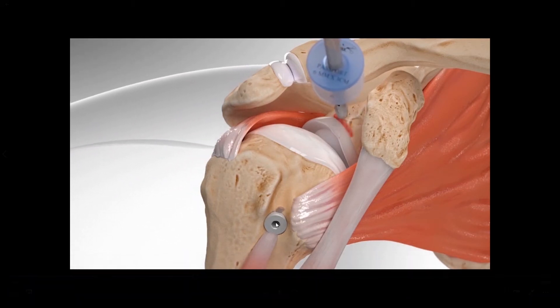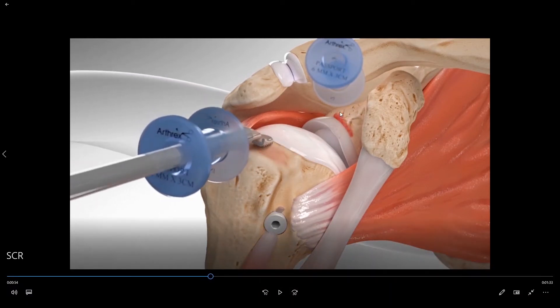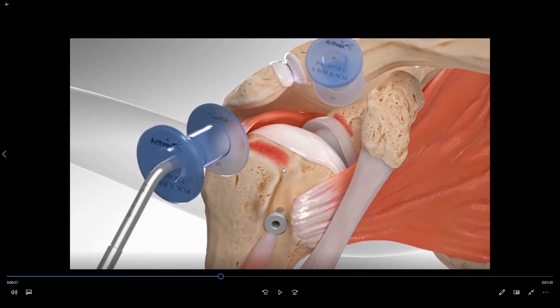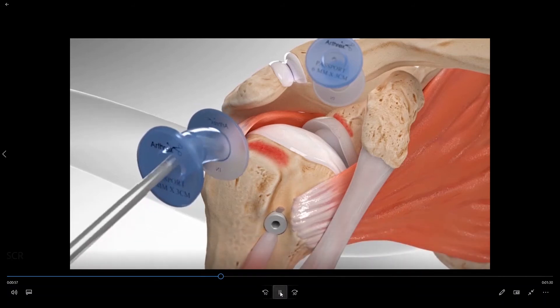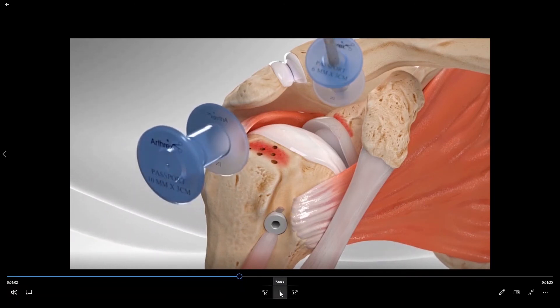We then create access to the shoulder through a series of portals via poke holes in the skin. Through the portals we want to roughen the bone up on top of the socket and then roughen the bone up on the top of the ball in order to create a bleeding bony surface for the superior capsule graft to be able to scar down to the bone. We then place additional trefinations, or holes, in the bone to create bleeding.